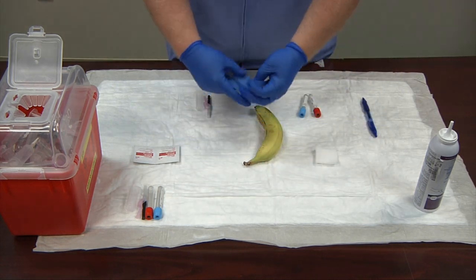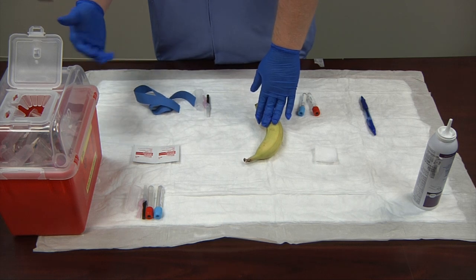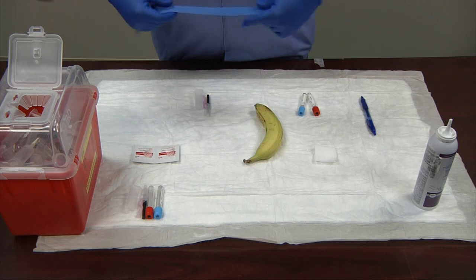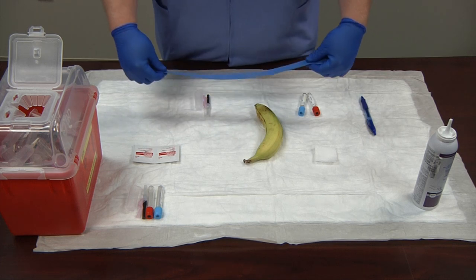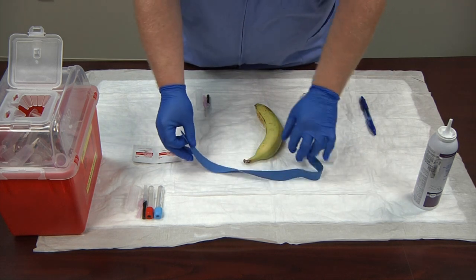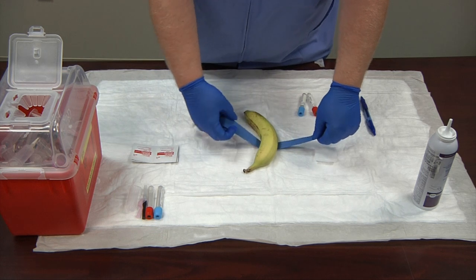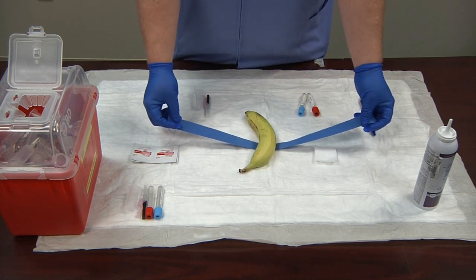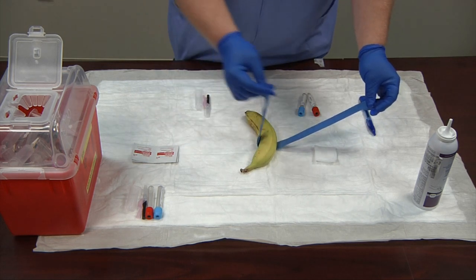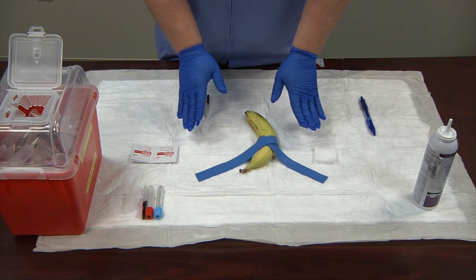Now I'm going to take my tourniquet. This is my pretend patient, Mr. Banana. I've already ID'd him, compared him to the requisition the doctor issued, the ID matches up, and I have informed consent from the patient. I'm going to wrap the tourniquet around Mr. Banana — we won't tie it all the way since that would be too rough on the banana, so we'll simulate this by just laying the tourniquet over.